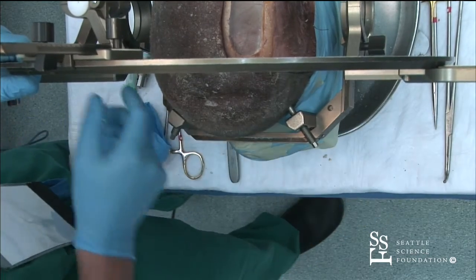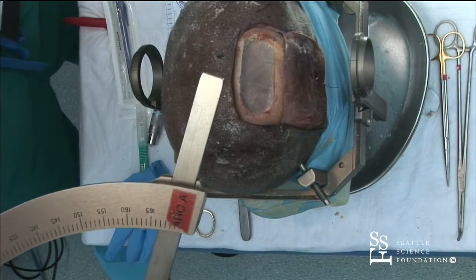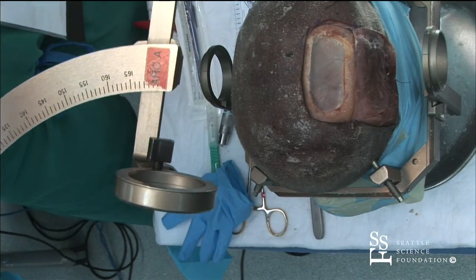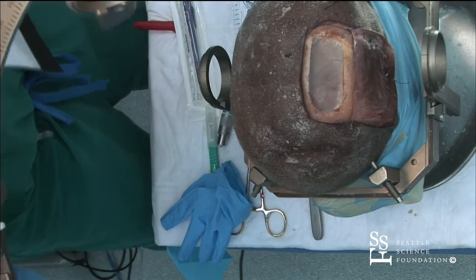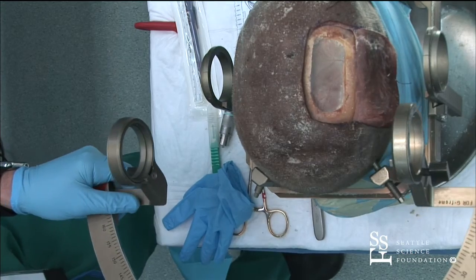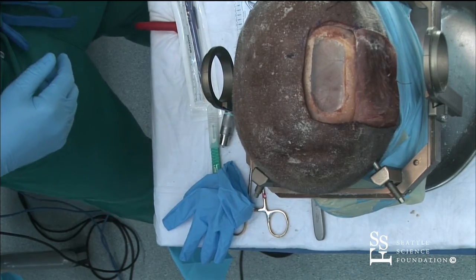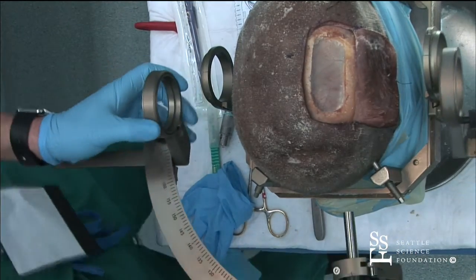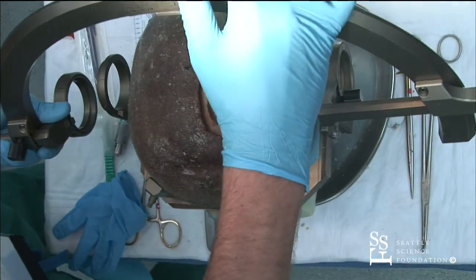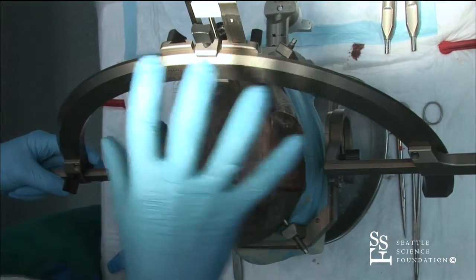There's two different depth electrode lengths for NeuroPace. There's a 44 centimeter depth electrode, and there's a 35, is it? Where's Chad? 30 centimeter depth electrode as well. The 30 centimeter depth electrode is not long enough to be held by the microdrive, which is typically used by people who also do DBS. So if you're going to use your FHC microdrive, then you have to use the 44 centimeter depth electrode. Otherwise, it will not be long enough to be held in your construct here.